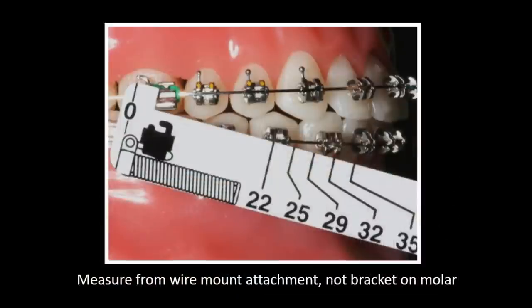If you use the ruler from older Forces kits — for an EZ module or L-Pin — what you see on the ruler is a picture of the bracket. For the wire mount, line the ruler up with the wire mount, not the bracket; if you line it up with the bracket, you'll end up over-activating. Put the distal behind the wire mount, then measure, and you'll end up with the right size. The number on the ruler includes the activation — do not add to it.